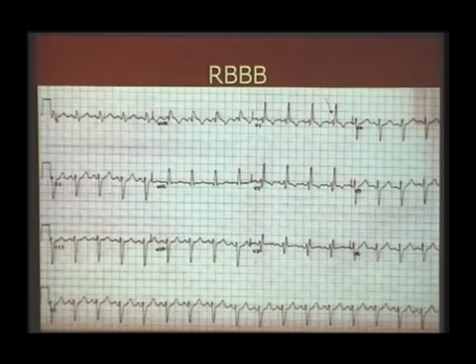Because the depolarization is delayed, you have secondary ST-T changes producing ST segment and T wave changes. The concept is that wherever the bundle is blocked to a particular ventricle, that ventricle is activated last, and it is activated through the muscle. So the last vector will come towards the ventricle for which the bundle is blocked. If the right bundle is blocked, the last vector will come towards the right side. That is the last ventricle to be activated and it will be activated through the muscle. So this results in terminal delayed positivity over V1, negativity in V5, V6, and secondary ST-T changes.